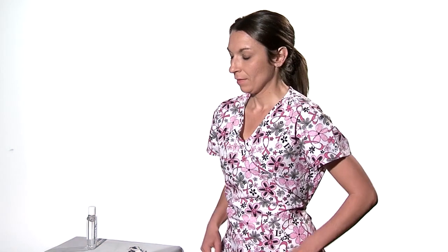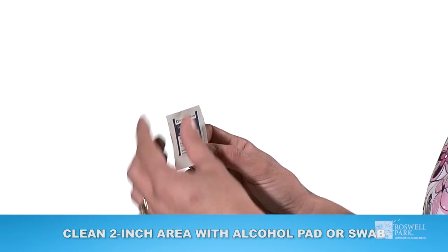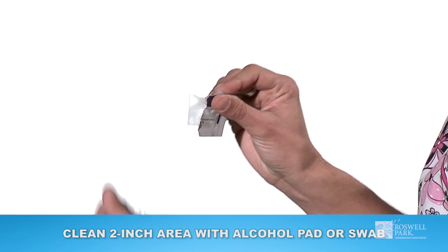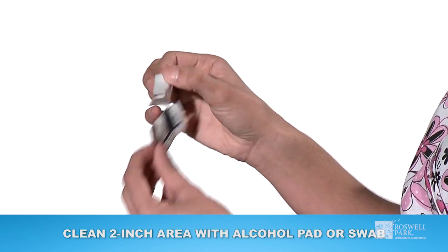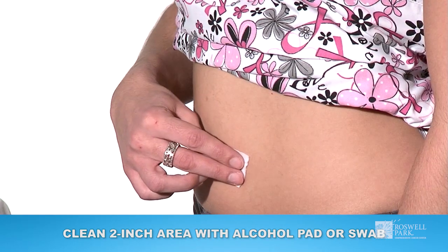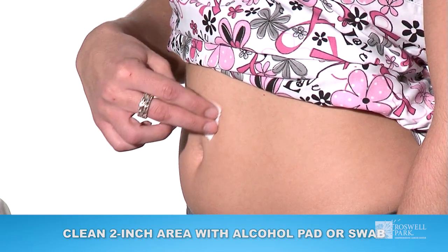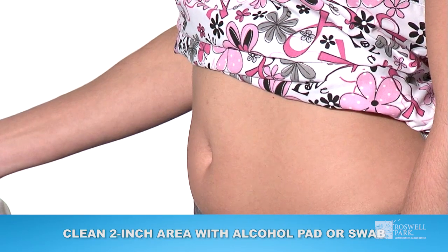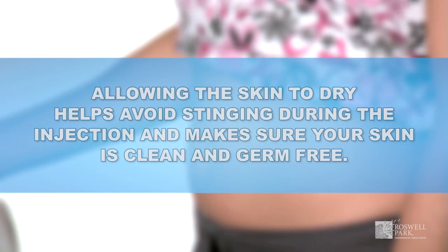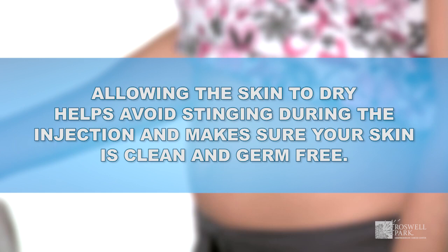After you have picked a location for the injection, you will need to expose the site and clean the area. Use an alcohol pad or swab to clean a two-inch area around the site you have chosen. Begin at the center of the site and move outward in a circular motion. Allow the site to dry, as this will help avoid stinging during the injection and make sure your skin is clean and germ free.